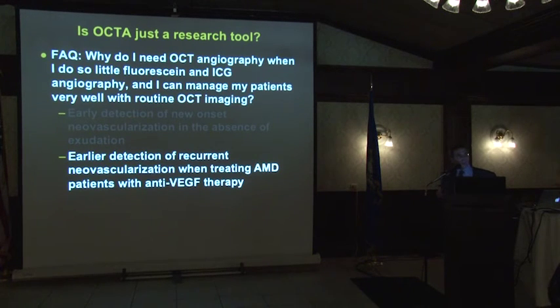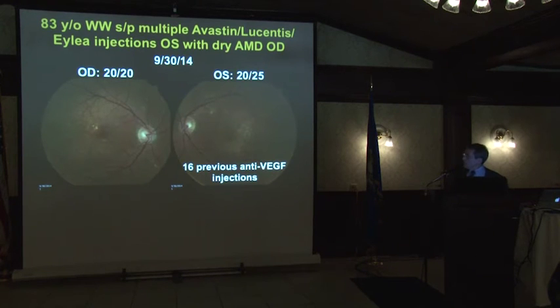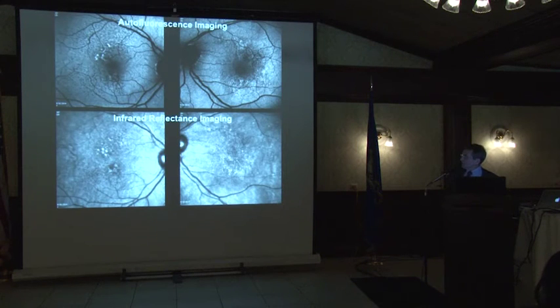So now let me just show you this great case about early detection, how it helps you with the management of wet AMD. So this is a patient that came in 20/20, 20/25 vision. This eye is getting lots of injections. This eye has never gotten an injection. This is what the autofluorescence in infrared looks like.